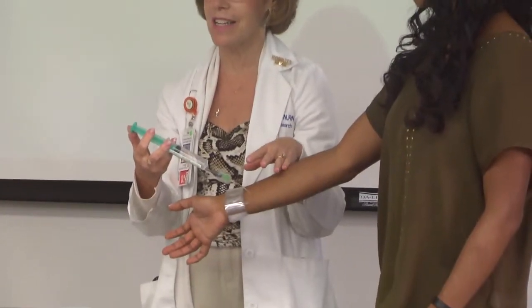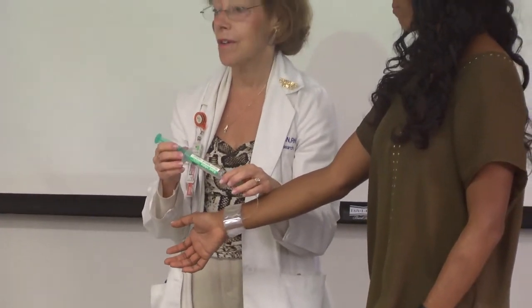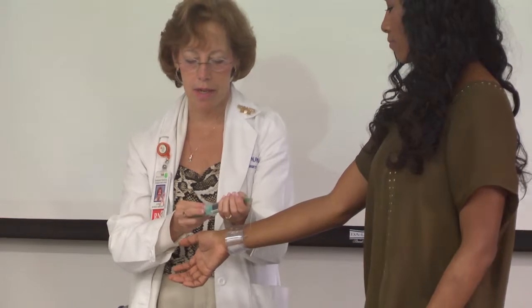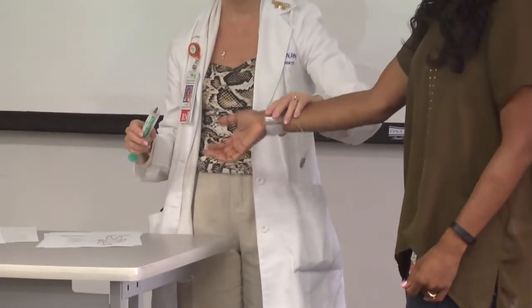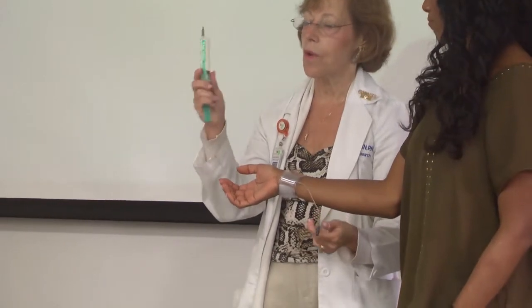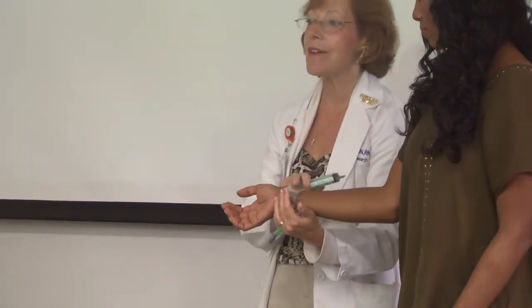So the idea is this is the pressure device so that post-op the patient isn't bleeding. Usually they use about 18 cc's of air. And then gradually post procedure, they're going to be releasing the air. There'll be lines on the syringe. So gradually you release the air, 2 to 3 cc's at a time. You'll get the patient like this, okay? So you're going to be checking to make sure there's no bleeding here. The nurse will hand off the syringe to you and let you know how much air is still in here.